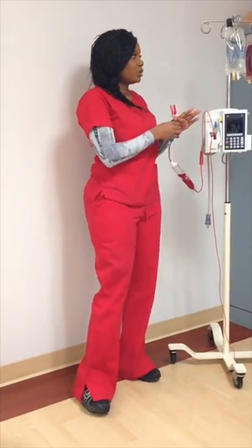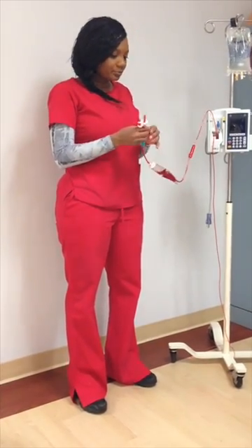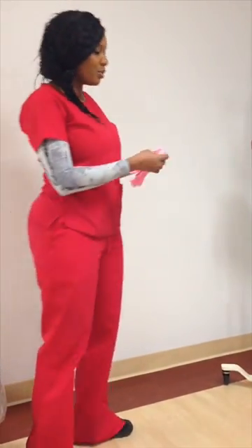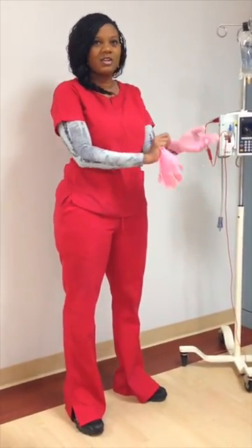Red blood cells are always transfused with a backup of normal saline — no other type of solution. You will always want to wash hands and glove up, which is very important when dealing with any type of bodily fluids. I know this is basic, but there's nothing wrong with a little reminder, right?